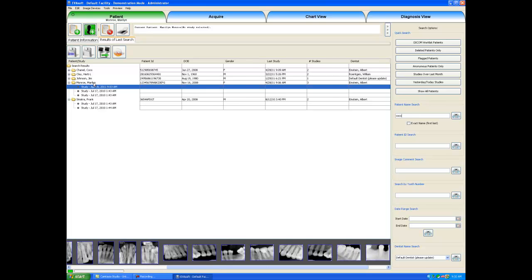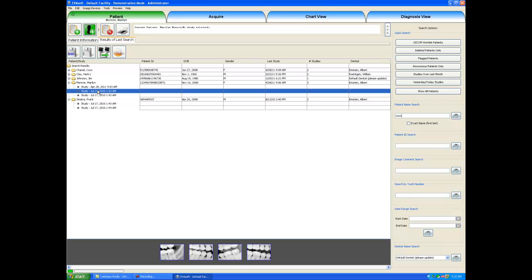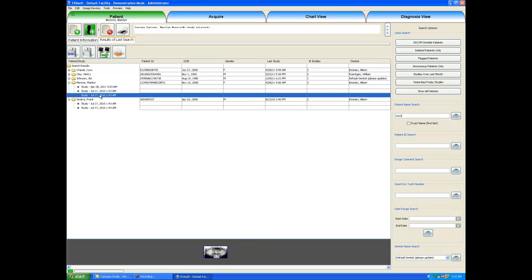If I were to click on a different study, all of those x-rays would show up. So on July 17, 2010, we took a panoramic x-ray.